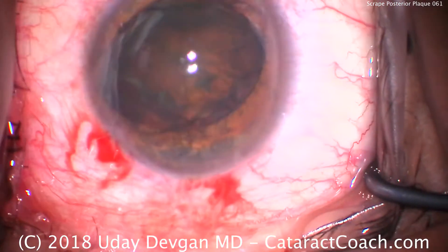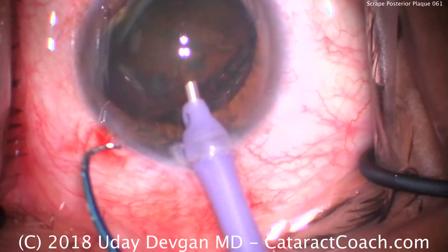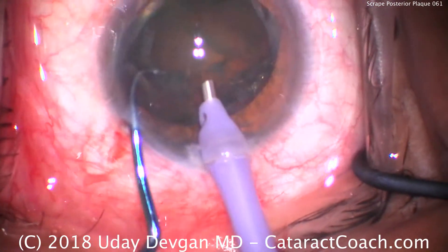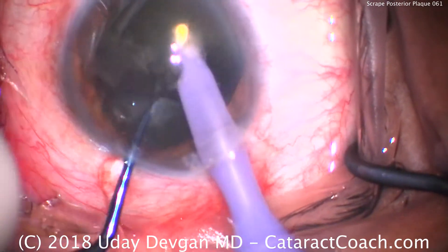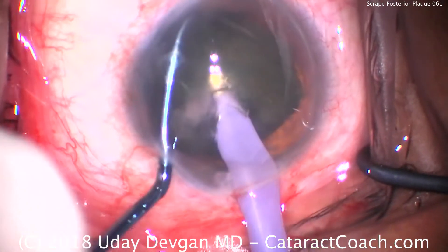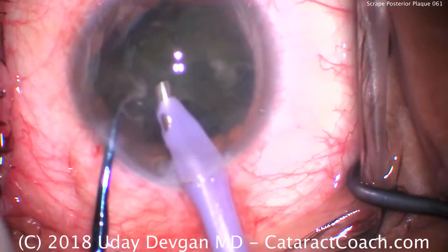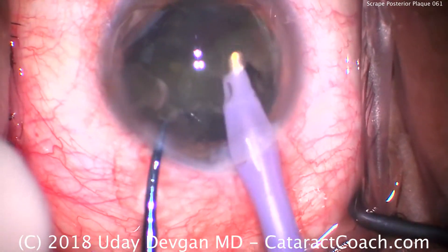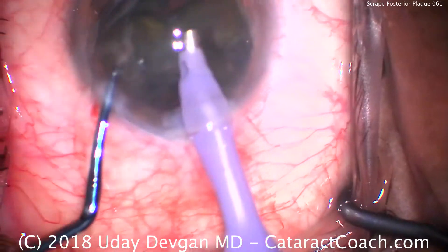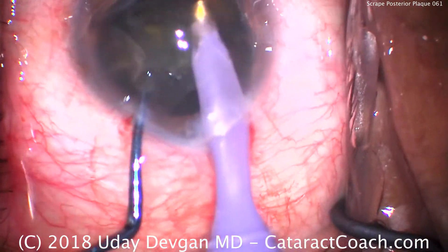Phaco probe going in the eye here — phaco probe in the right hand, chopper in the left hand. We have a high flow rate, 50 cc's a minute, vacuum 500, power about 50%. Chop the nucleus in half, now chop it again into quarters. The key here is to keep the phaco probe in the center of the eye and use the chopper to keep the nuclear pieces in front of the phaco probe.